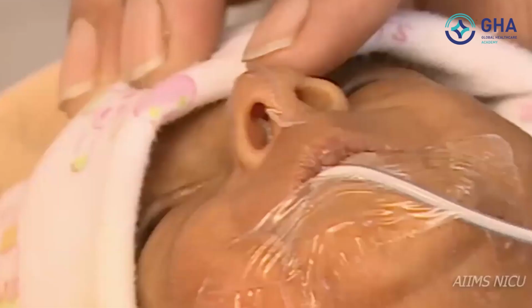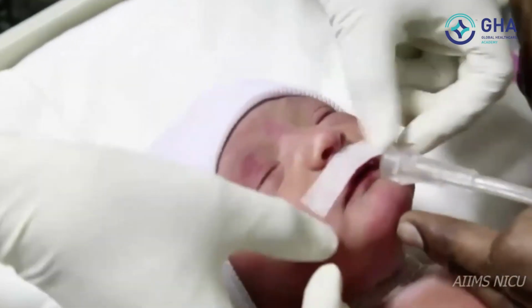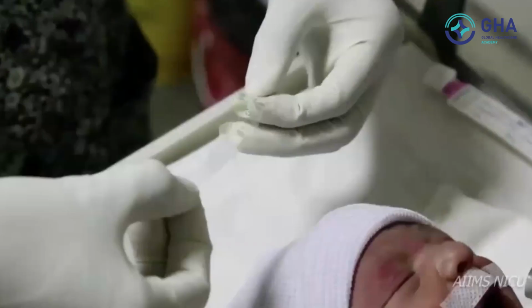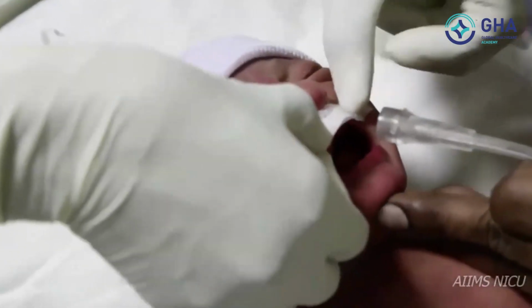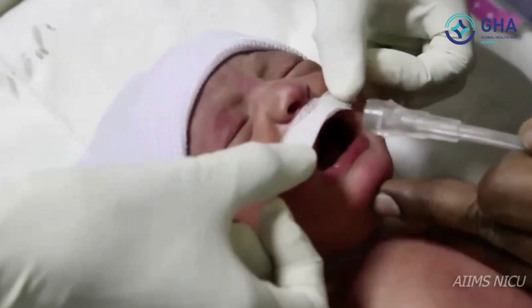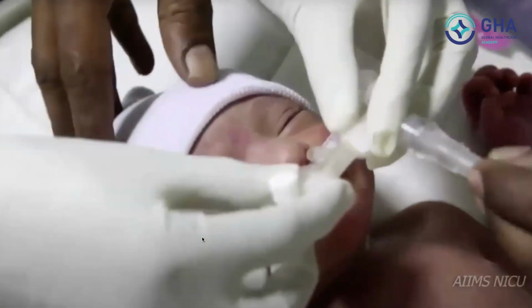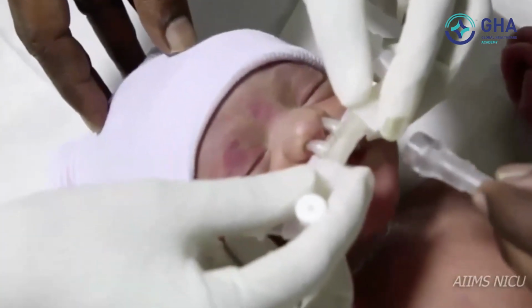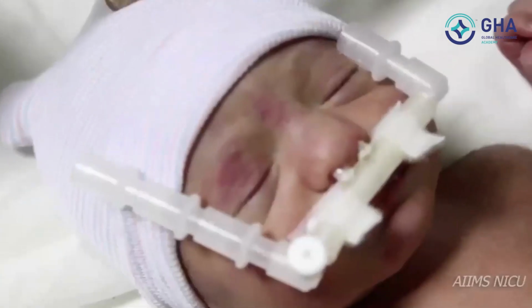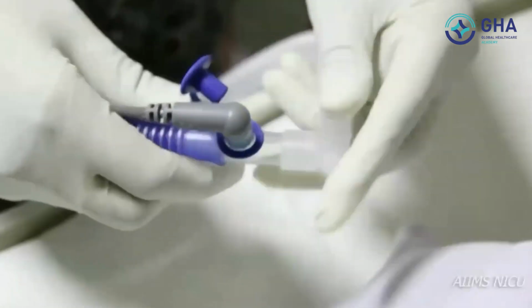Fix the Tegaderm and the rough Velcro on the philtrum to form a base, as shown in the video. Insert the nasal prongs into the nostrils and fix them to the base. The soft Velcro on the prongs locks with the rough Velcro on the philtrum.